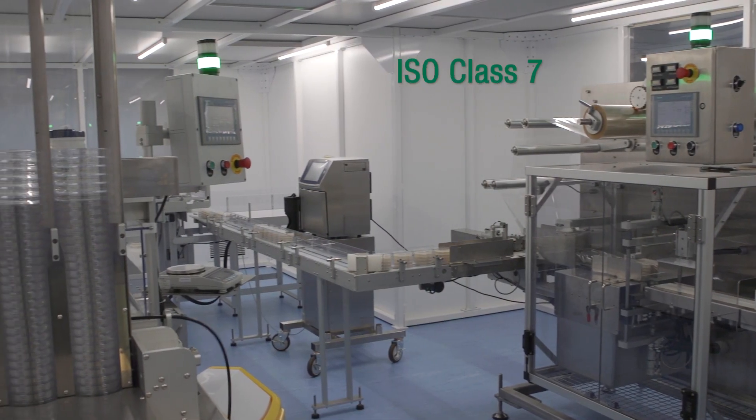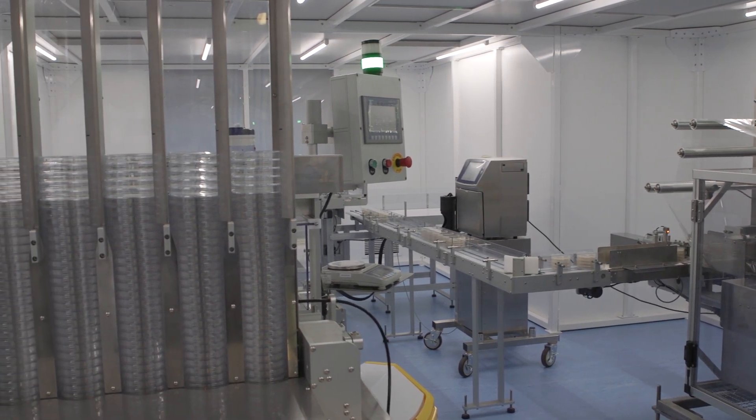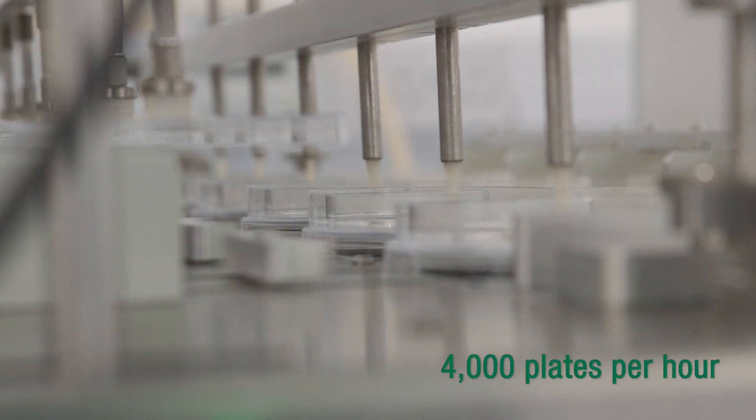This is our ISO class 7 clean room and houses our M4000 automated plate pouring equipment. Our equipment has the ability to make in excess of 4,000 plates per hour. Plates are manufactured through six lanes ensuring a constant supply.